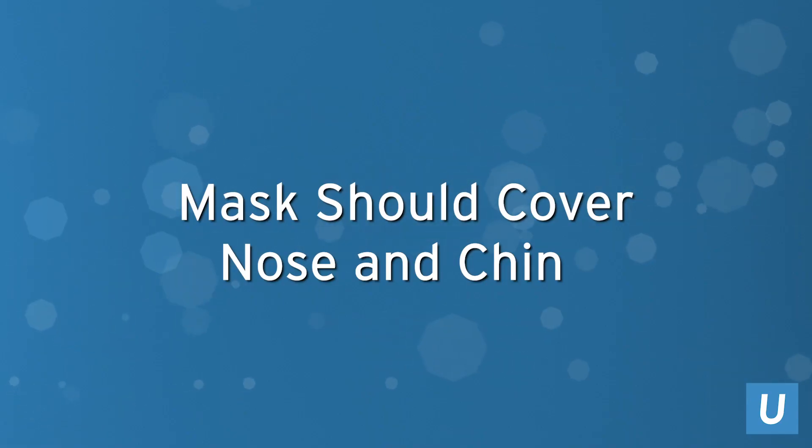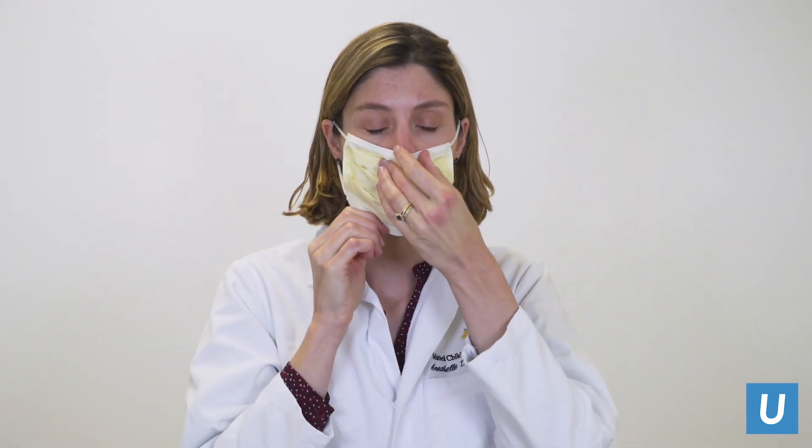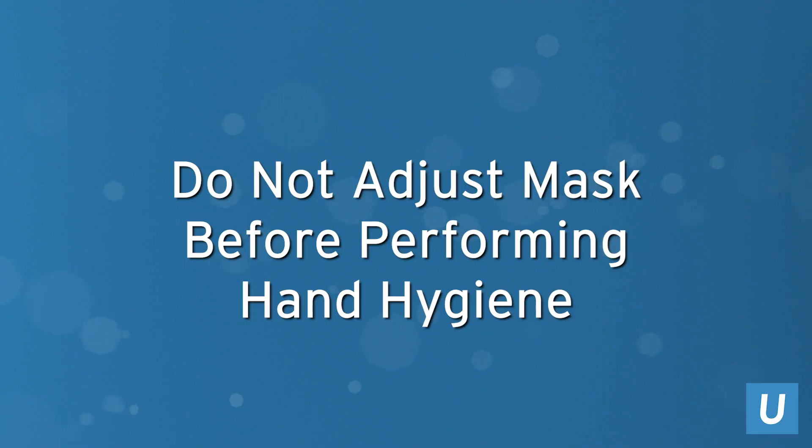Your mask should always cover your nose and chin. The most common improper use of a mask observed is not covering your nose. It is important to cover both your nose and mouth whenever wearing a mask. Do not adjust your mask after it is in place without performing hand hygiene first.